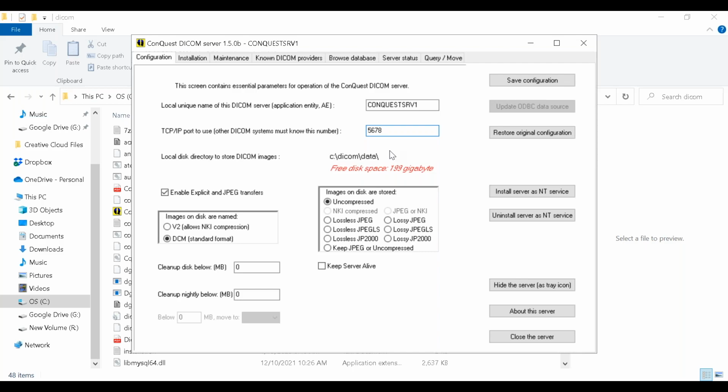Yeah, okay. So that's basically a face roll. They basically put their fingers down and went 5678, why not? There, done. It could have been anything else, 3321, for example.